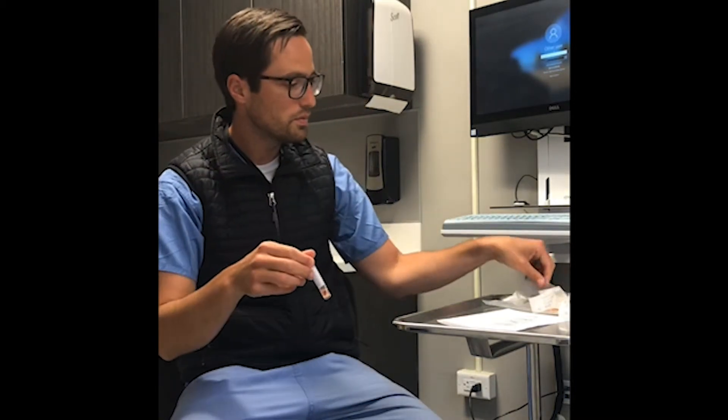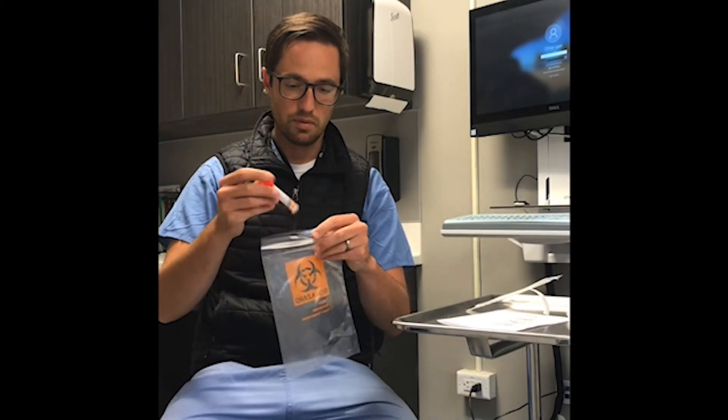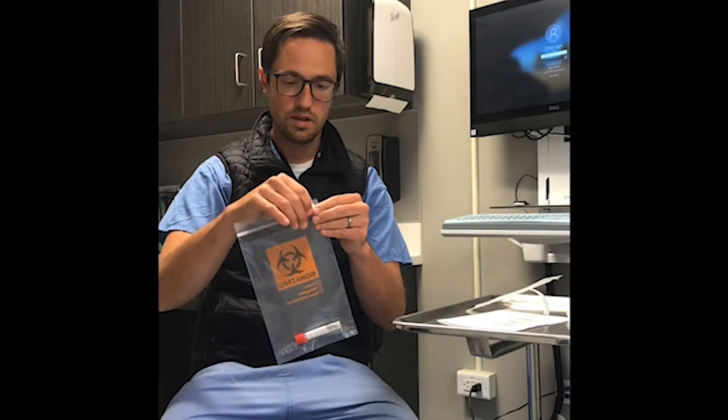Firmly close the tube. Place your sample into your bag, seal it, and leave it on the stand. Wash your hands and you're good to go.